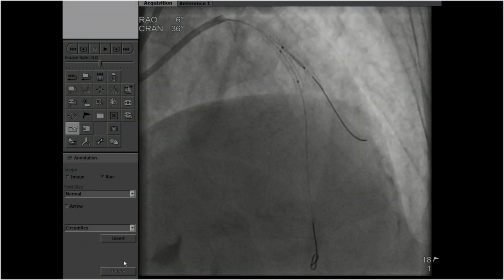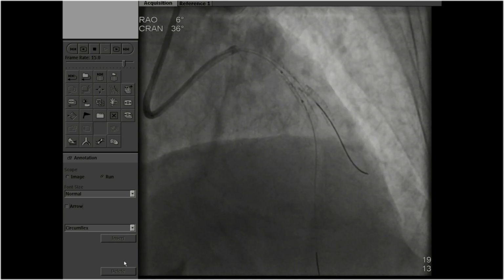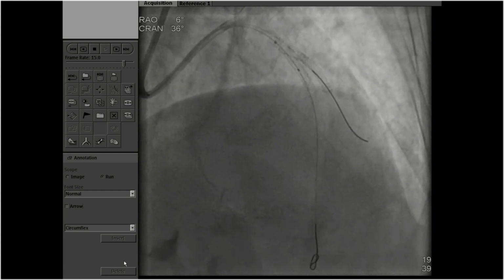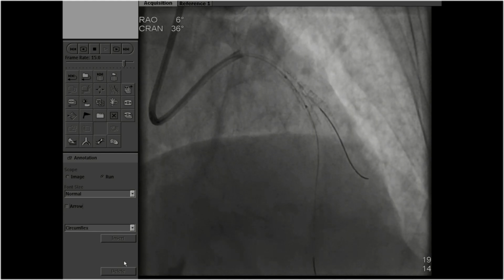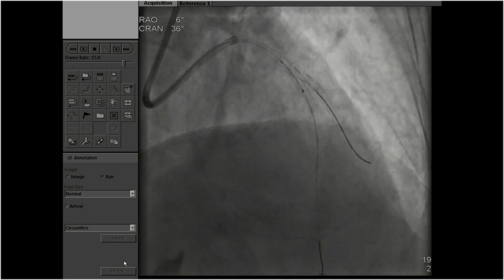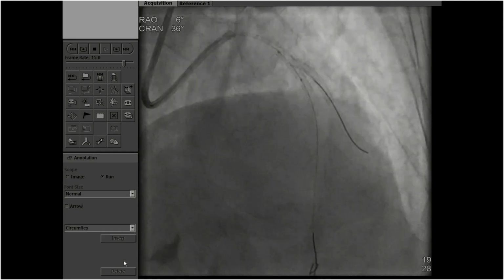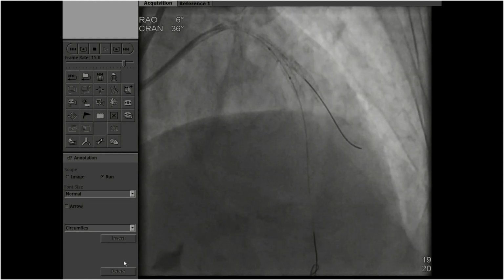So we said that's the way we'll put a short 8 millimeter stent. You see at least 2 millimeters into the LAD. We deployed. Now look at it. You see at least 4 millimeters, 5 millimeters. You see the roof, it's covered, right? And this is the TAP technique where the lower portion of the side branch stent is in the main vessel. We had a balloon across before we did that, you see? So that's how we deployed. We pulled back, deployed to make sure it's covered.